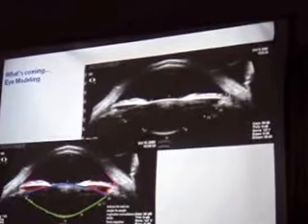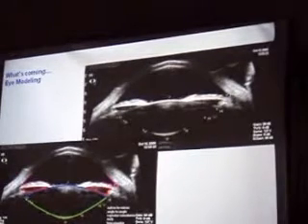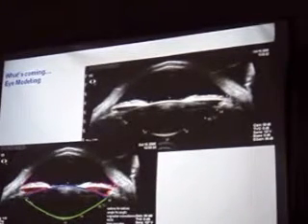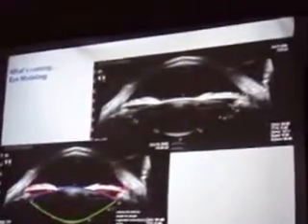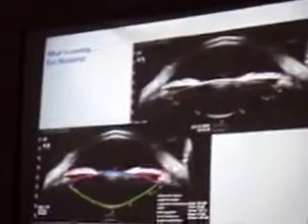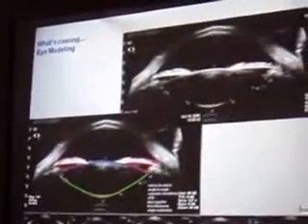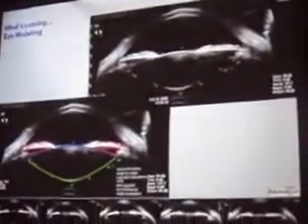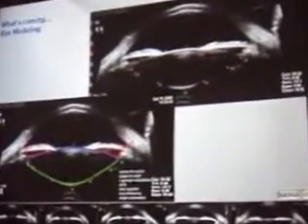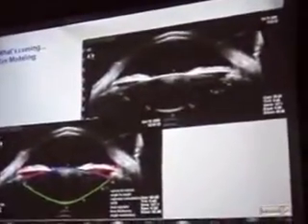We're trying to identify, by just indicating some points on the eye, a kind of wireframe of the eye, which will provide us an idea of how the eye is going to look, or what the interrelation is between the anatomy inside the eye on a given patient. Steep eye, flat eye, myopic, hyperopic. It's a whole world to be discovered there.